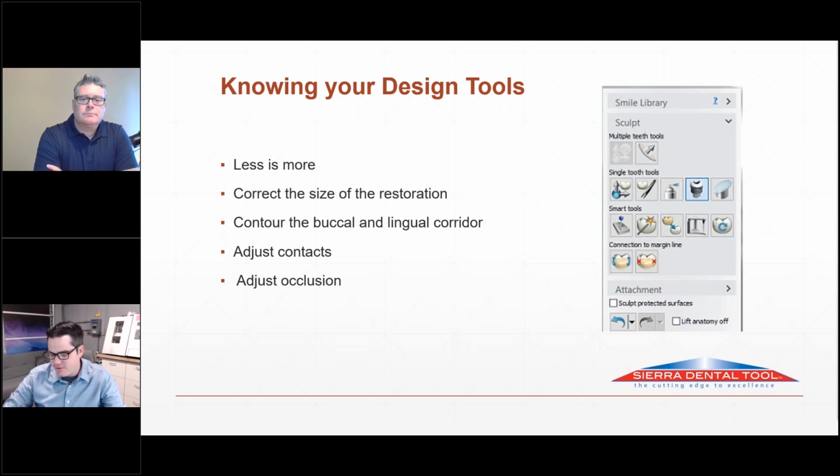What that enables you to do is that you don't have to take your hand off the mouse to move the keyboard when you're working, and it makes you a lot more efficient. When I discovered that, I had designed 80,000 crowns by the time I figured that one out, and it was night and day. I was like, wow, I'm 30% faster because I figured this out. So anybody I'm talking to about design, I'm like, buy a gamer mouse, just do it.